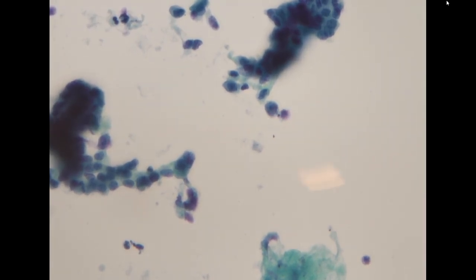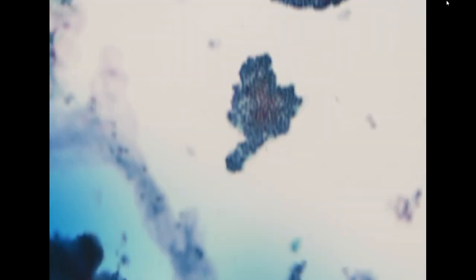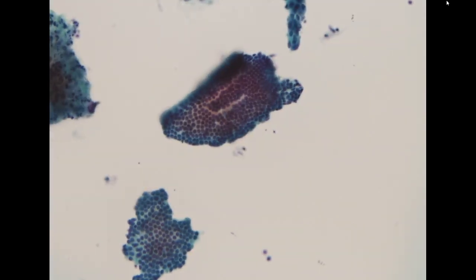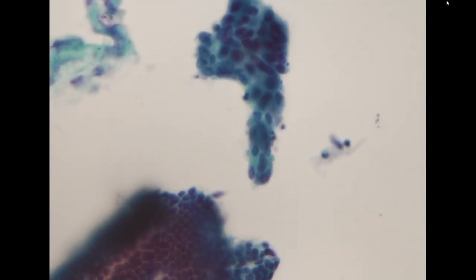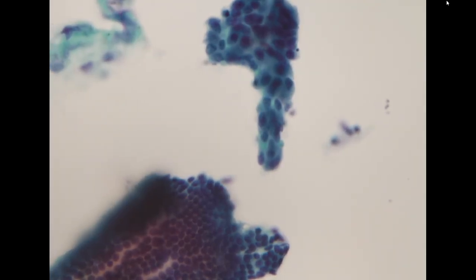So these are adenocarcinoma cells. In this specimen, the cancer cells are not so many, but we can see this is a very good contrast.